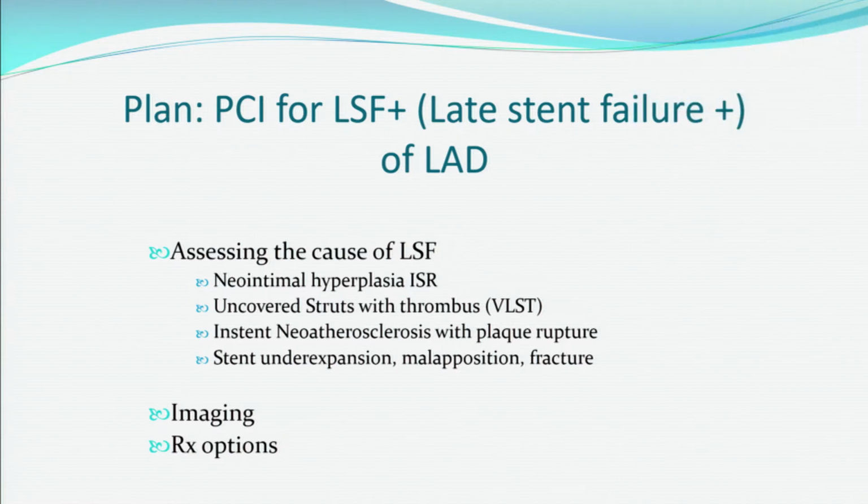What do you think? What are your thoughts now? Bad compliance to the dual antiplatelet therapy. You see this mass in the stent.